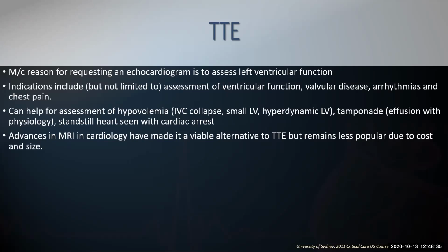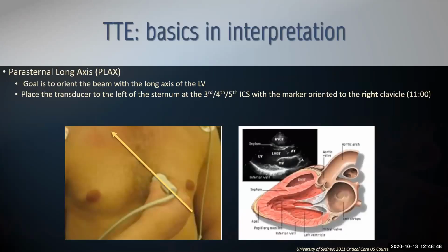Advances in MRI in cardiology have made it an alternative, but it's not going to replace the echo because of the cost and the fact that an echo is portable, whereas the MRI requires a gigantic machine that many hospitals can't afford. This was discussed last Friday, I believe, by Dr. Duffy, where he did a very good discussion on echo and some of the ways to get the imaging and showed some videos. If you didn't get that, it is on the private YouTube playlist.